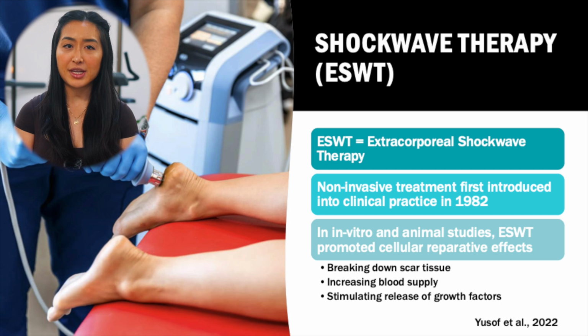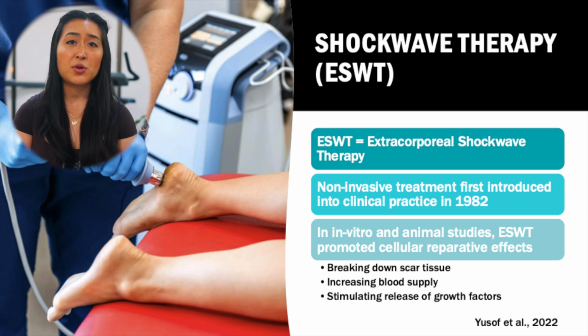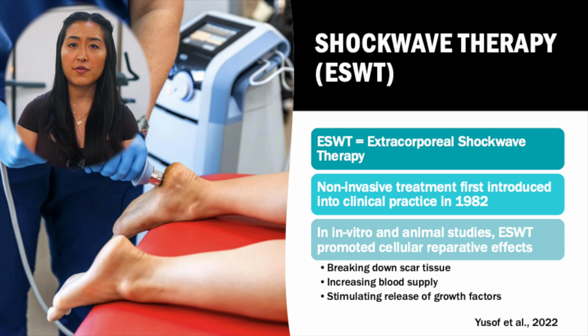Shockwave therapy can be abbreviated with the letters ESWT, which stands for Extracorporeal Shockwave Therapy. Shockwave therapy was first introduced into clinical practice back in 1982, and ever since then, it has been a beneficial inclusion to the non-invasive treatment options available for numerous orthopedic pathologies. Even though this non-invasive treatment option has been around for over 40 years, it really isn't until the last decade or so that it has become more widely used in physical therapy clinical settings. That is why a lot of clients who come to see me often have not heard of shockwave therapy before, even though they have done physical therapy in the past.